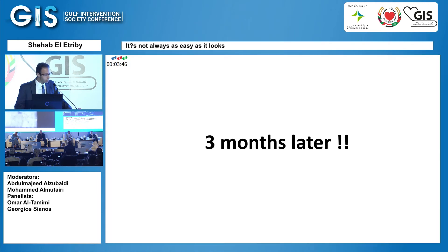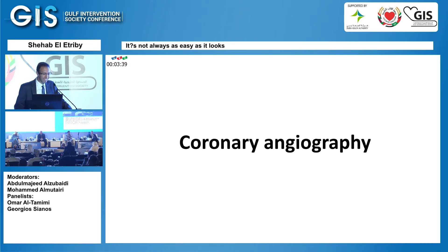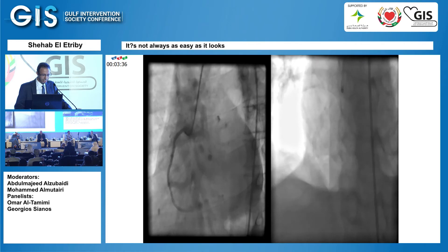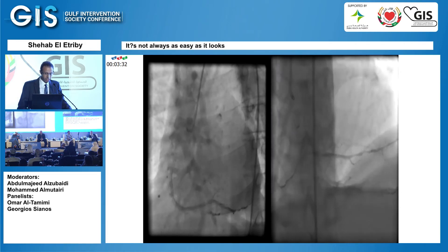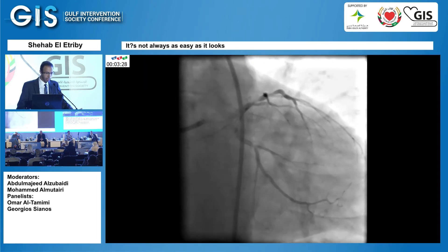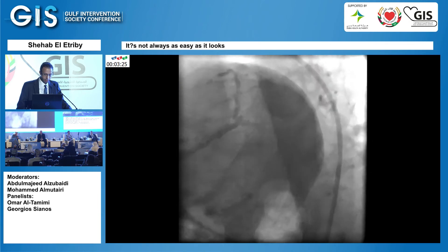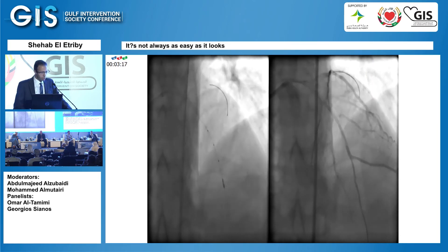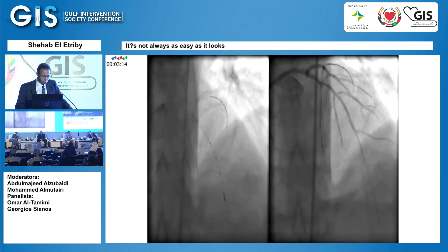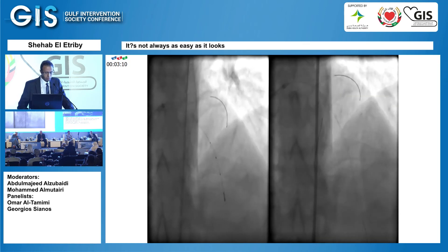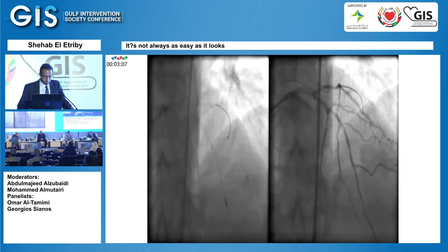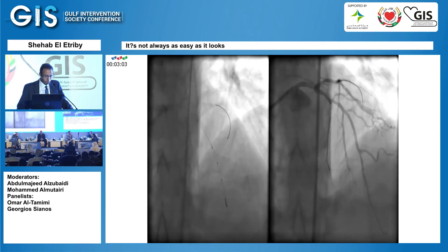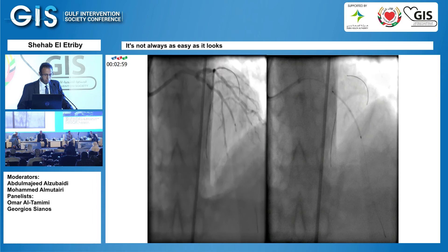We decided to do the left main in another session with a seven French catheter, IVUS, and stent optimization. The patient disappeared for three months — I thought he had died — but he came back. The control angiography of the right coronary after three months showed everything was well, and the left main was luckily the same. I did IVUS of the LAD and left main. He had two large septal branches, so I put a wire in the larger septal with subtotal ostial stenosis and placed the first stent, a 3 by 38.